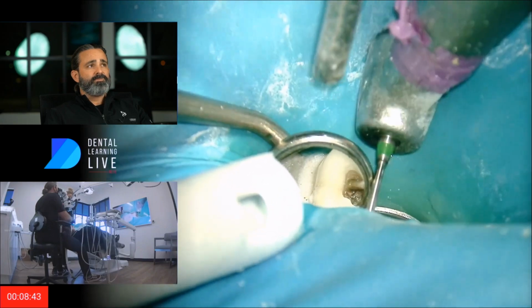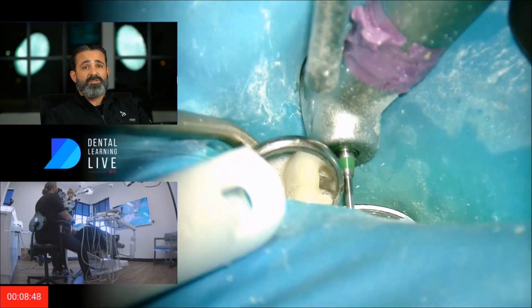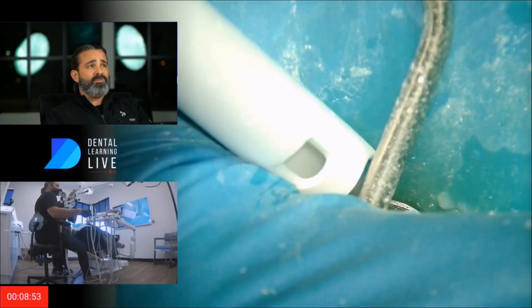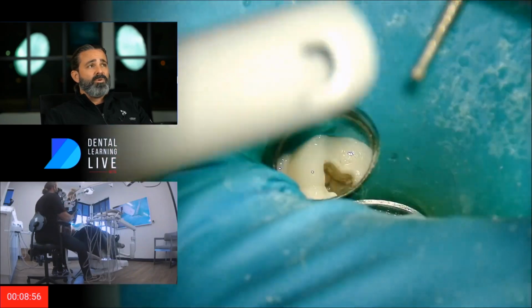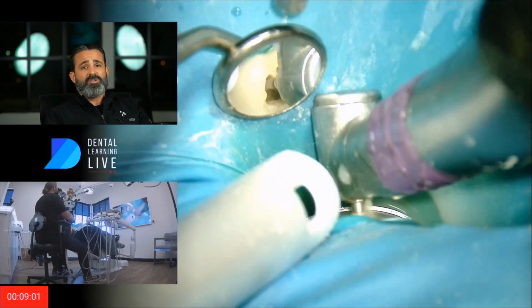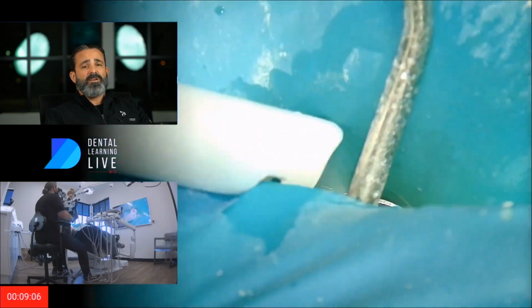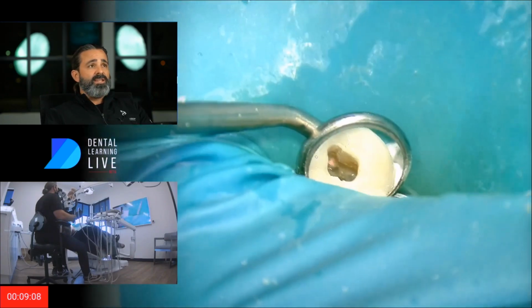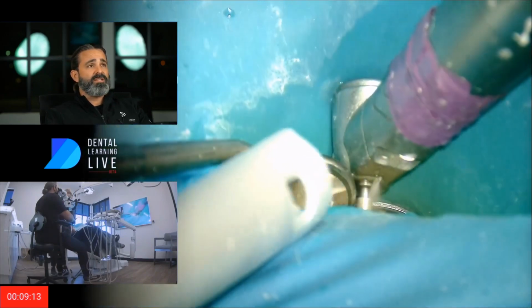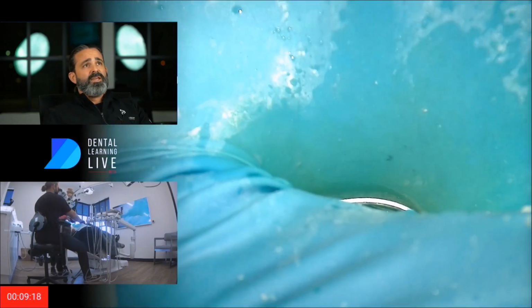from the cone beam. Like I said, there wasn't anything. And you know what? With that X-ray, both X-rays, the 2D and the 3D, showed me that I really wasn't expecting to find any discoloration or leakage, or the materials were composite and a crown. And so I wasn't. You know, sometimes when I get into these older gold crowns or silver crowns and different kinds of materials inside, when I access it, I'm seeing all sorts of funky geology going on. They look like different layers of rock inside there, and stainage and colors, just like the Grand Canyon, looking at sediments of rocks. And I think about that all the time.